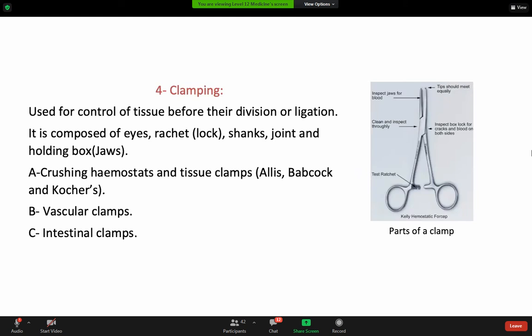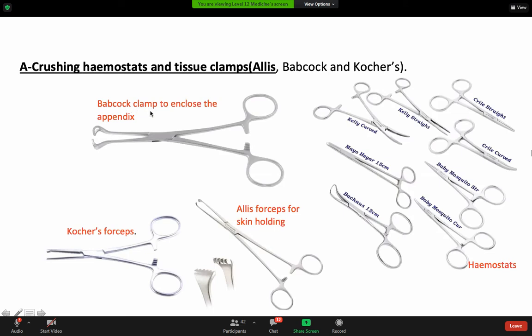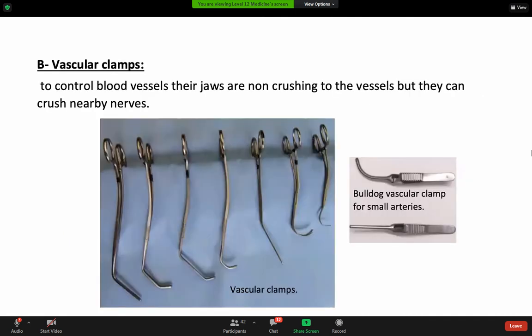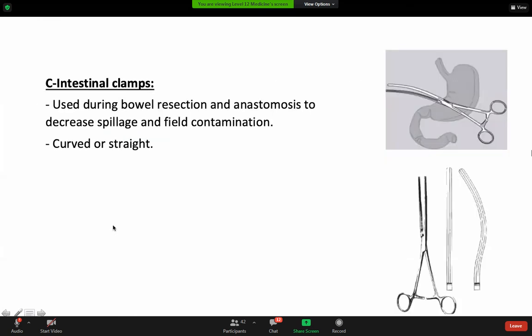Clamping instruments include vascular clamps, intestinal clamps, and crushing hemostasis and tissue clamps. The Babcock clamp, for example, is good for clamping or handling the intestine or bowel. The Kocher clamp is designed to grab or clamp tissue. Vascular clamps, like the Satinsky clamp, can be used to clamp the aorta. The intestinal clamp is used during bowel resection and anastomosis.